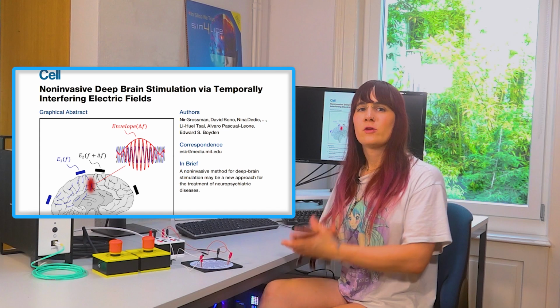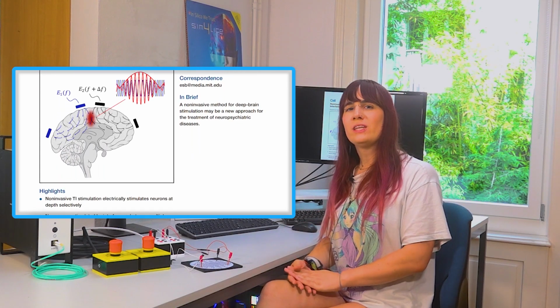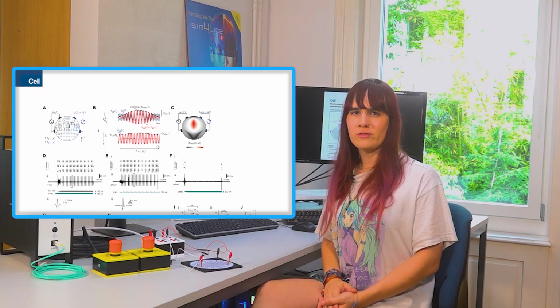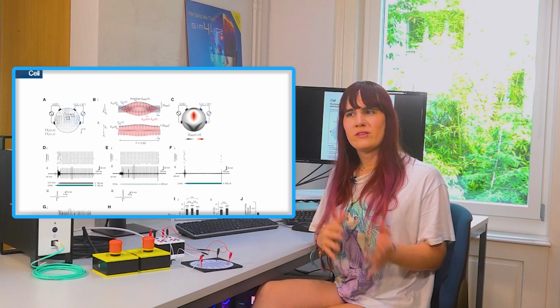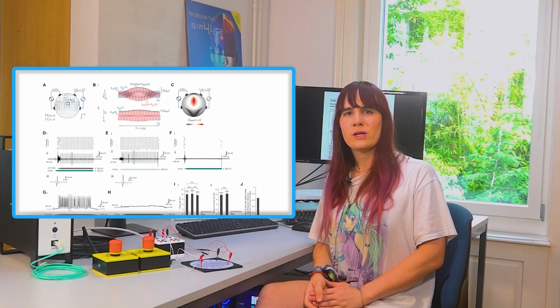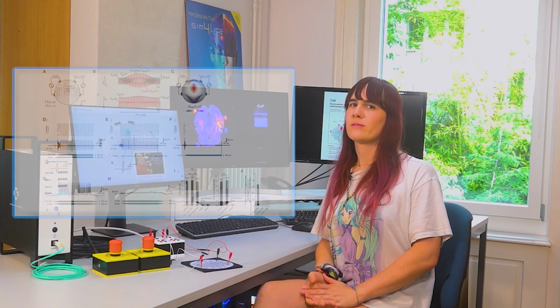TIP is a computational modeling tool designed to assist researchers in optimizing electrode placements and currents for their temporal interference stimulation studies. TI is a non-invasive electric stimulation technique that can be used to reach deep brain targets. It works by applying 2 or more high-frequency currents with slightly differing frequencies or phases to produce a low-frequency envelope modulation in the regions where they overlap, to which neurons can respond.